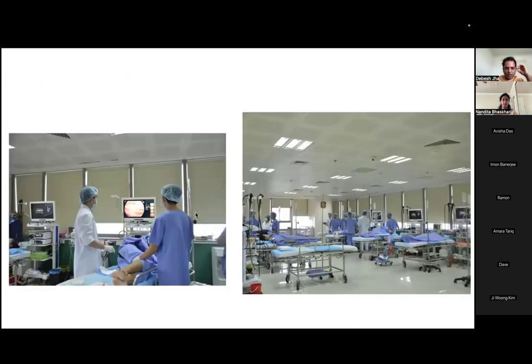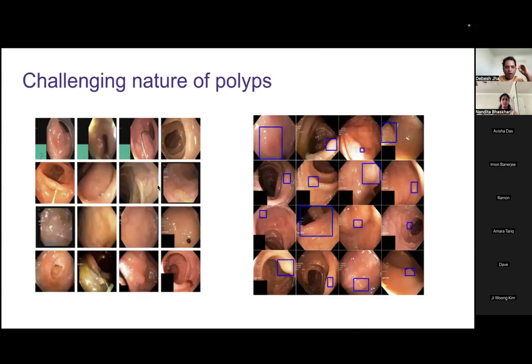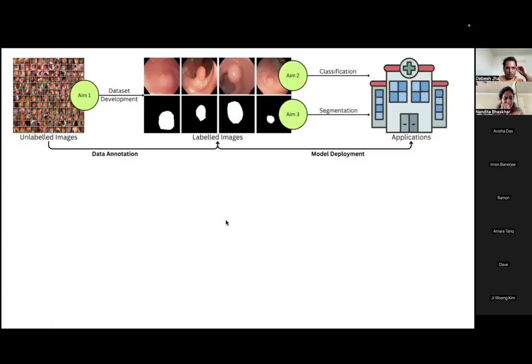This is a picture of the clinical procedure. The reason why colorectal polyp detection is challenging is that the polyp surface looks the same as that of the mucosa, and there are also low lighting and flare artifacts. Also the size or structure of the polyp matters. For example, this is a flat polyp. Doctors usually miss polyps like this, which look like normal tissue. So there is a high miss rate because of this kind of region.